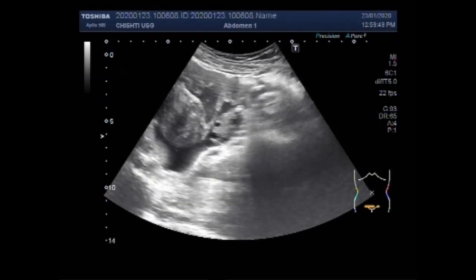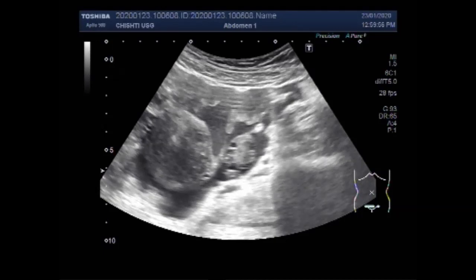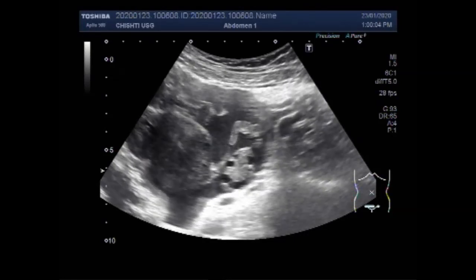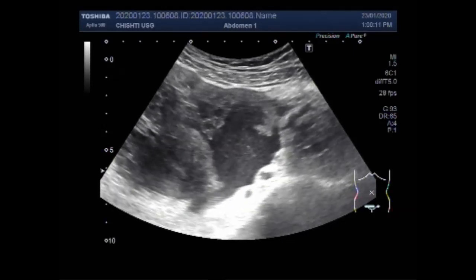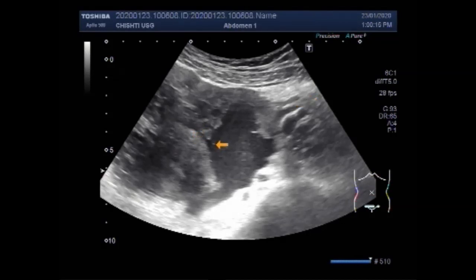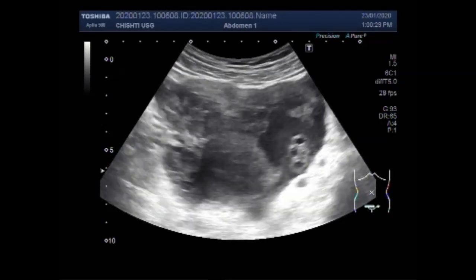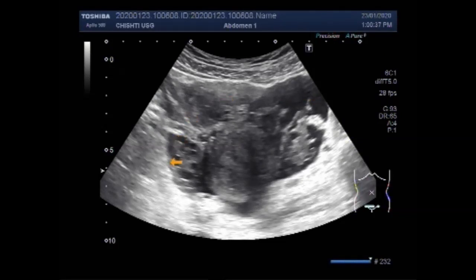You can see the thick fluid around the right ovary and the breach in the fallopian tube is also seen. The left ovary is also visible, but only a little fluid is seen around it. The thick free fluid is due to the rupture of this fallopian tube ectopic pregnancy. Again, both ovaries are visible and you can see the difference — the fluid is predominantly seen around the right ovary.